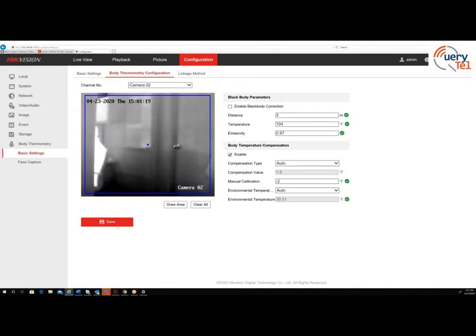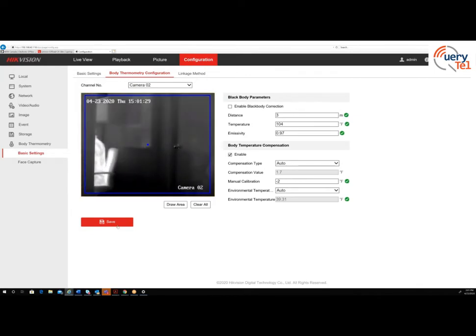Although we have implemented in a live environment, based on our experience, I'm telling you that you will have to adjust. First of all, you cannot put it right up 4 feet away from the door. You have to be at least 7 to 10 feet away for the installation. Because when the doors open, outside is warm weather or cold weather, and it's cooler. So when that cold air or hot air comes in, it changes the room temperature itself.